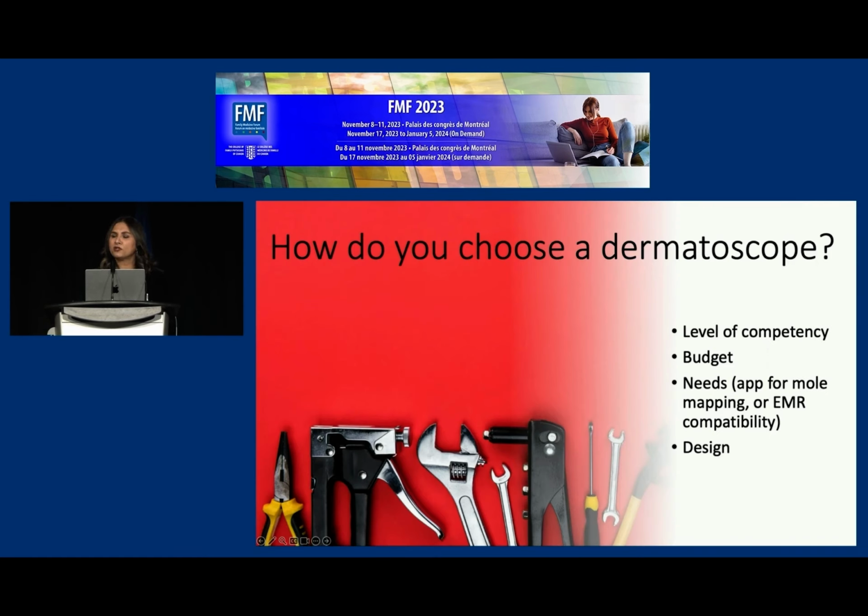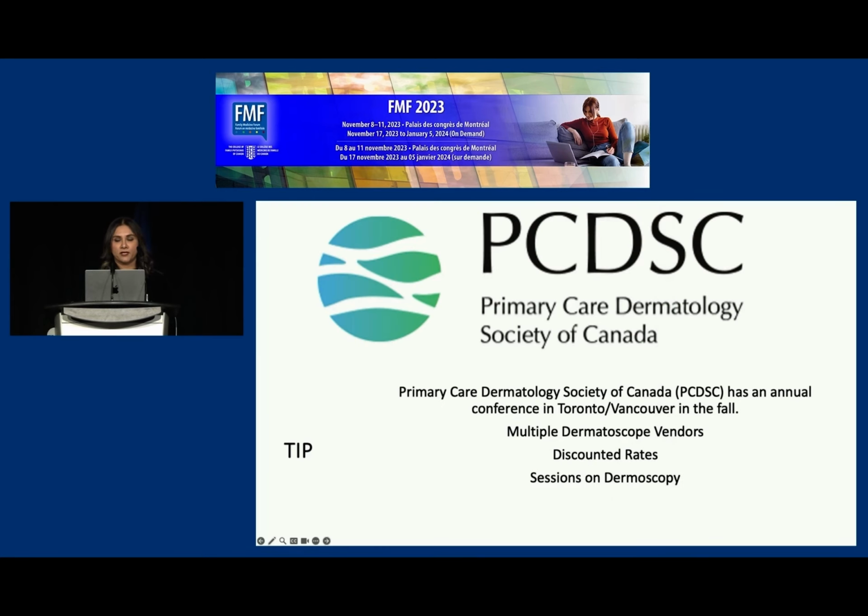So how do you choose a dermatoscope? Obviously it will depend on whether it's entry level, if it's your first dermatoscope, your budget, the design of it, and your needs. So do you want to use an app for mole mapping like the Heine? That was one of the reasons why I chose that one. And if there's one that's more compatible with your EMR, you'd go for that.